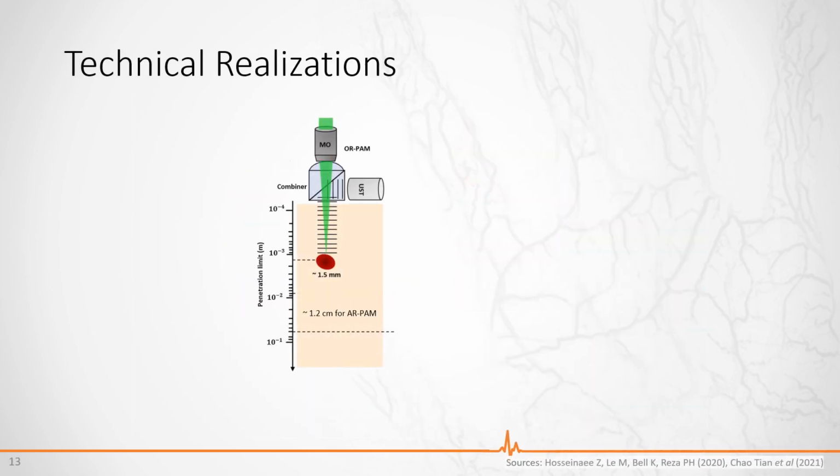There are mainly two groups of PAI instruments. The first group are photoacoustic microscopes. There, a laser sends a pulse to a target and a single ultrasonic transducer is used for detection. There are versions like this one shown here, which mainly focus the laser to achieve a high resolution, actually quite similar to fluorescence microscopy. And there are versions which mainly focus the emerging ultrasonic pulse to achieve high imaging resolution, called AR-PAM.